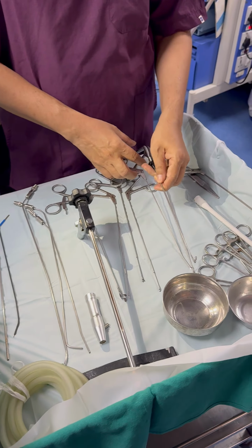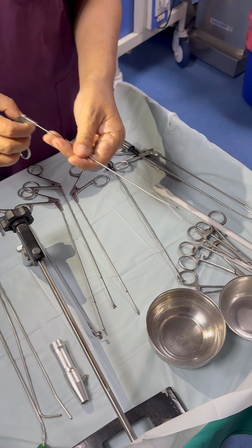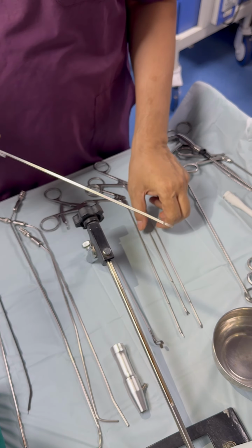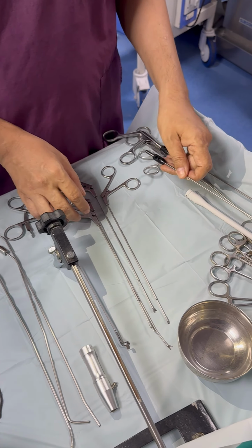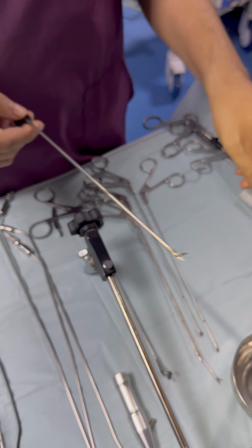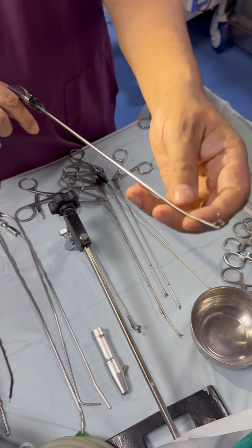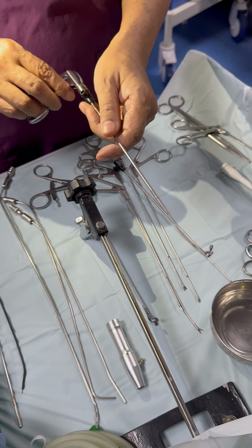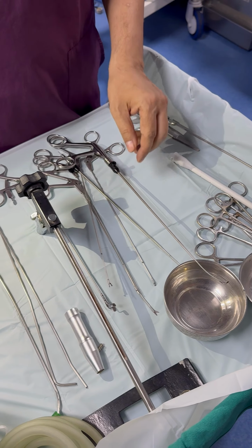Then there are tilted instruments like the scissor. We can see there is a 15 degree tilt anteriorly. Then there are malleable instruments available in stores. So this is a scissor which we can turn. This is a forceps which we can turn whatever the need is. So these are the instruments which can be helpful in operating anterior commissure.